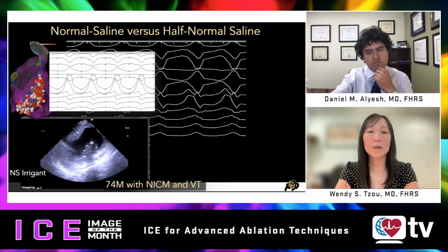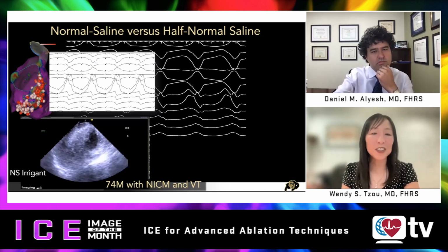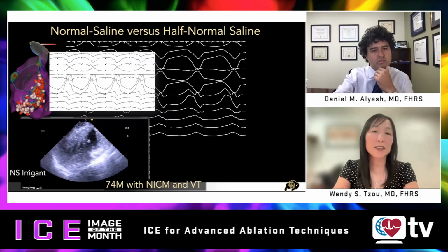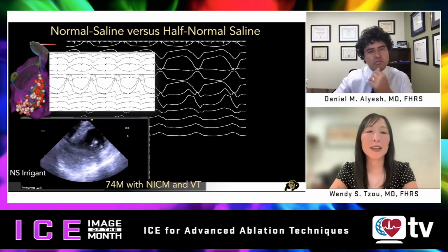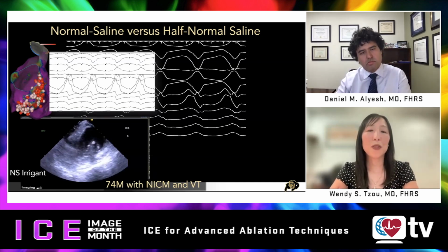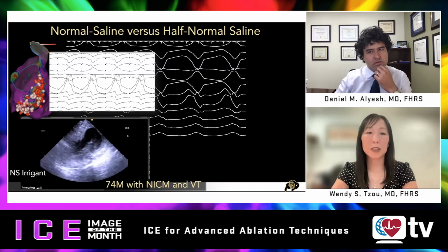there that you've got some depth of penetration with the hyperechogenicity compared to baseline, but you can see that it doesn't quite reach to where that substrate is of potential interest. And in fact, the tissue there, when we're pacing at output that is not that high, still confirms that there's absence of electrical inexcitability. And on top of that, he's still inducible for the clinical VT. So we can't go epicardial easily in this patient because of the fact that he's had prior cardiac surgery.